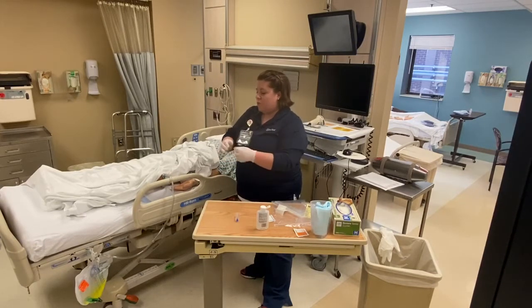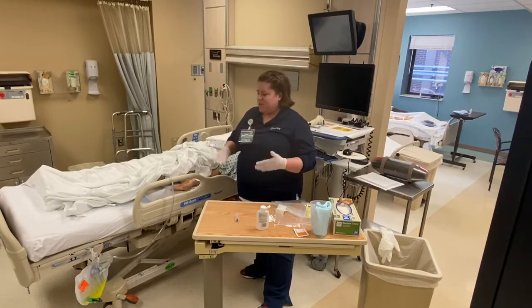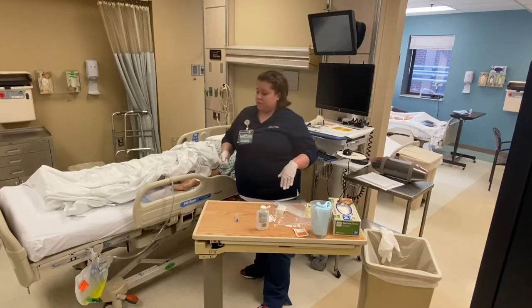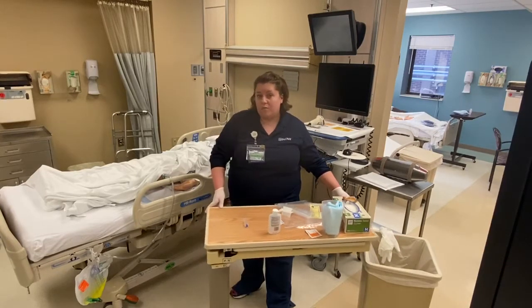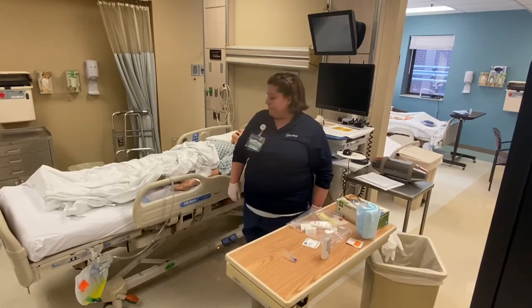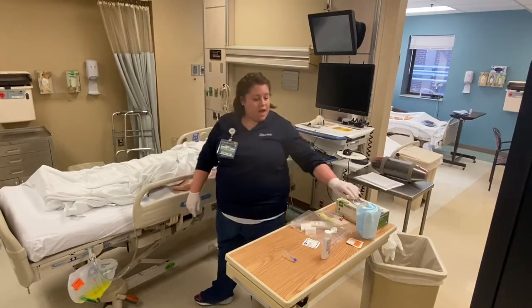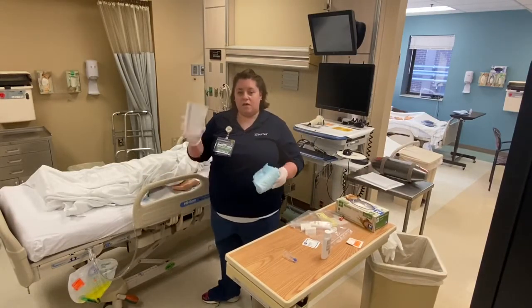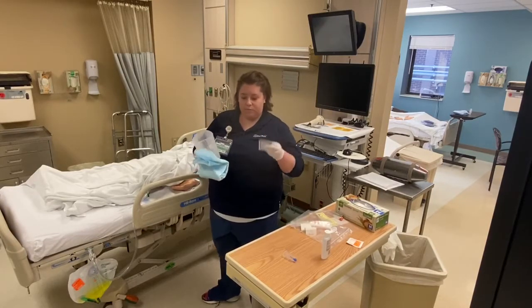However, you also want to empty the bag when it's 1/2 to 2/3 full, because you don't want the bag to get too full. You're also going to empty the bag before you take the patient for a walk, before they ambulate, before they go to any sort of procedure, okay? So I'm gonna come over here to my Foley bag. I'm going to bring with me a graduated cylinder, a pad, and some alcohol, okay?